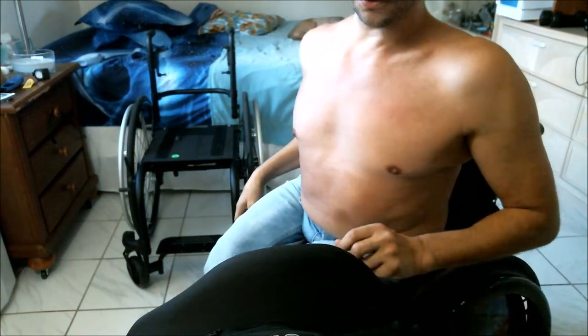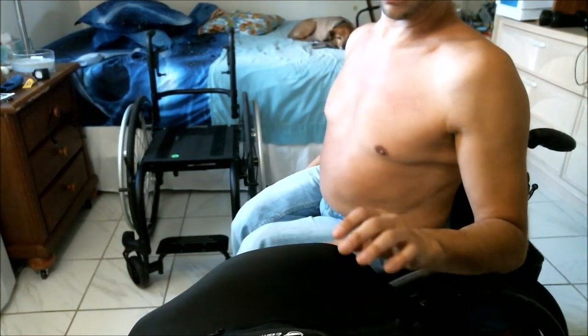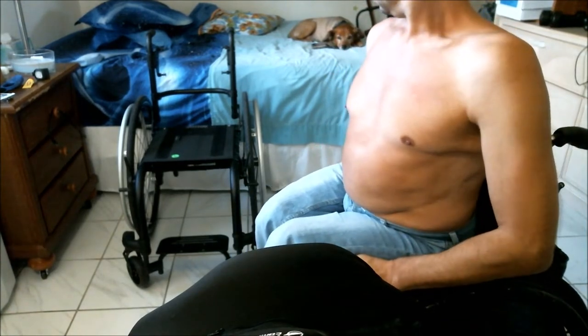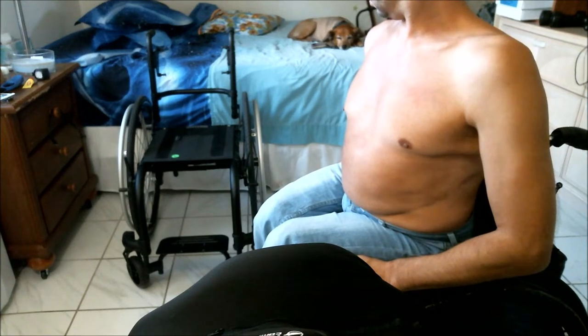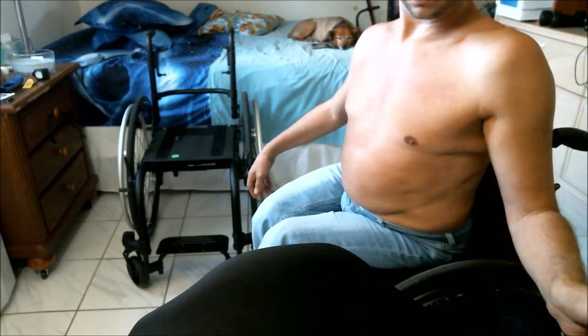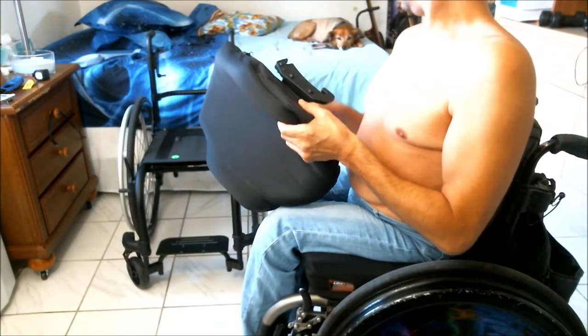I'm going to lower the camera so you can actually see the chair and compare it to my current or old chair, so my face is going to be cut off quite a bit. You can see the back is sitting right here, so first I'll explain about the back.